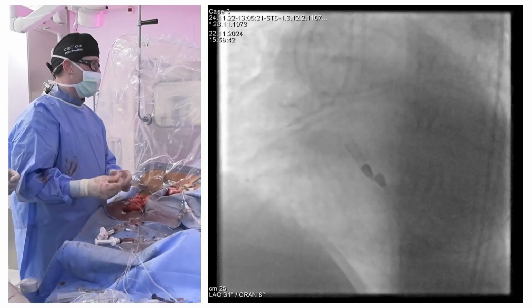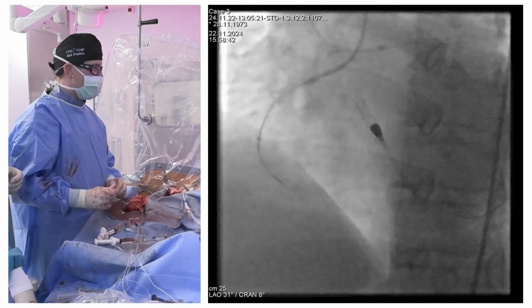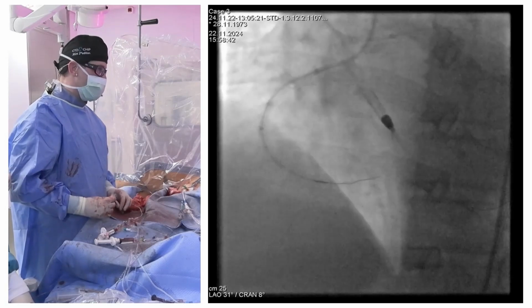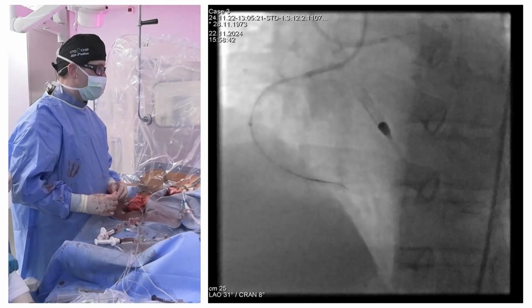So I could even try to find some septals, even though they have not been visible in the beginning, and try to get the PD branch retrogradely. I'm not sure if I'm going to do this. This might be something you can stage too, but we will see.